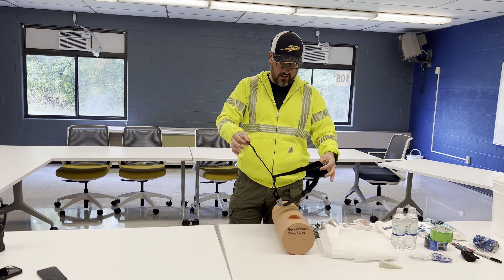We're assuming you're treating someone else, and in a tourniquet situation they're probably already on the ground. You want to get the tourniquet all the way up — say the wound is here — you want to be a couple of inches above the wound. In this case we're simulating the leg this way. Step one: you want to tighten the velcro as much as you can. That's really important — we don't want a loose initial application.